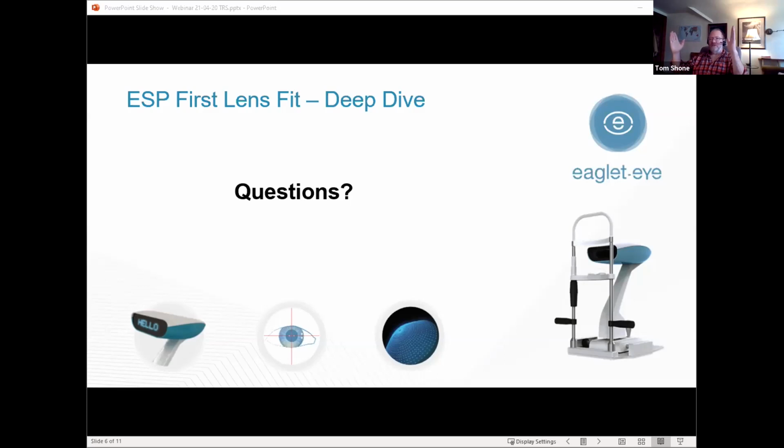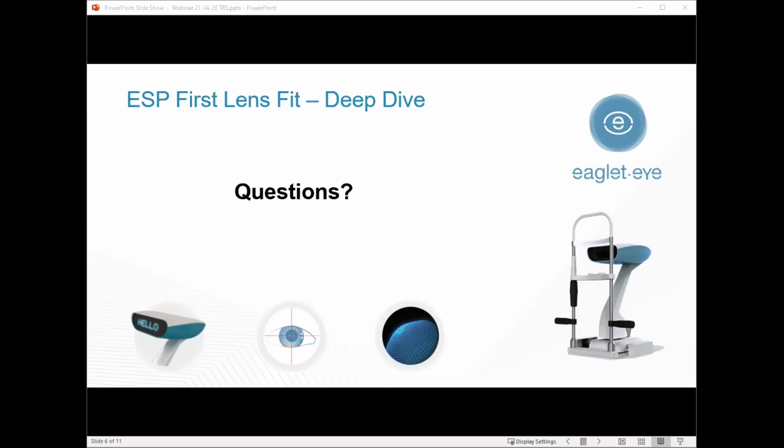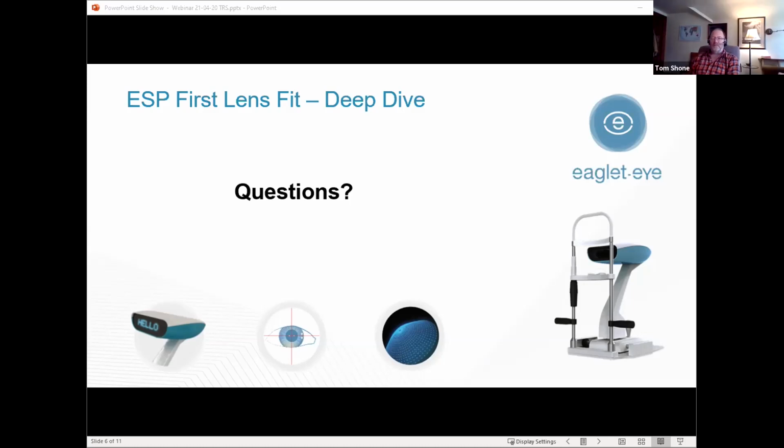I was talking about start to finish, having the patient sit in, get lubed up, till the end. And Brooke mentions that the image itself, click, click, click, is faster than the processing time. The processing time depends on how fast your Wi-Fi or your Ethernet connection to the cloud is. The 500,000 data points have to go up to the cloud, be processed, and then come back down. So that could be anywhere from 10 to 30 seconds, depending on your internet speed.